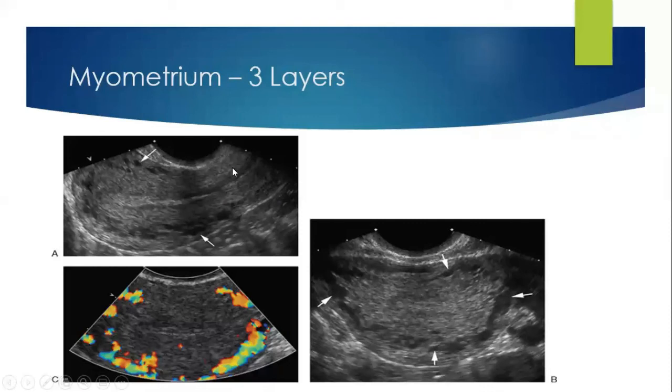Zoomed picture of a transvaginal probe section showing a mid-sagittal section of the uterus with this white hyperechoic endometrium. This is the innermost layer of the myometrium, which is thin and a little darker. Then comes the intermediate layer, which is more homogeneous and thickest. Then come the arcuate vessels, and outer to this is the outermost layer of the myometrium.